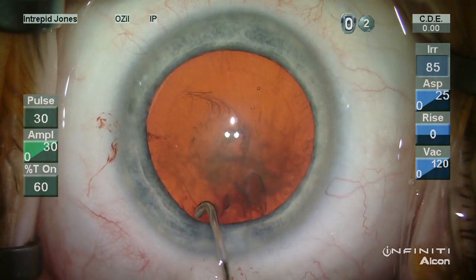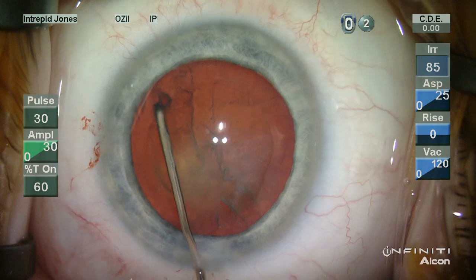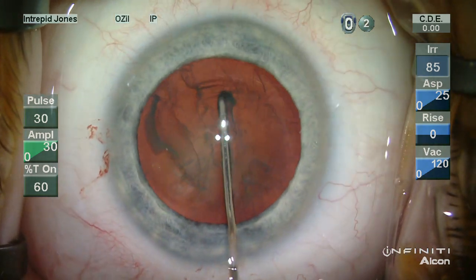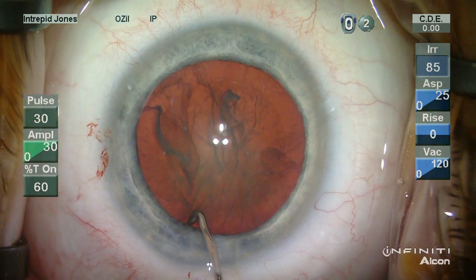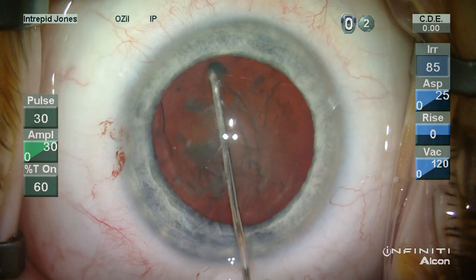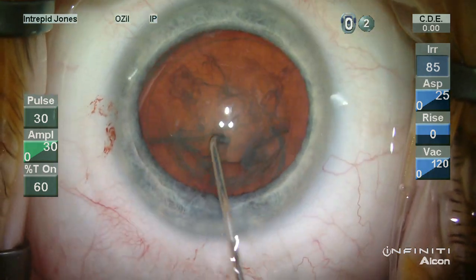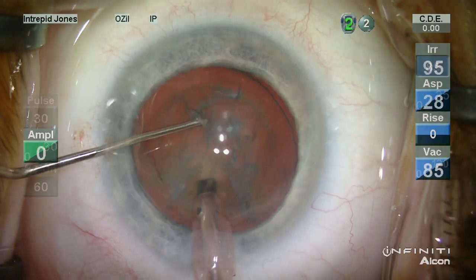Hydrodissection is very important, especially in these softer lenses. You can see the fluid wave is completed around the fornix of the bag with the initial wave and decompression, and then the second wave is propagated followed by multiple hydro delineation movements.